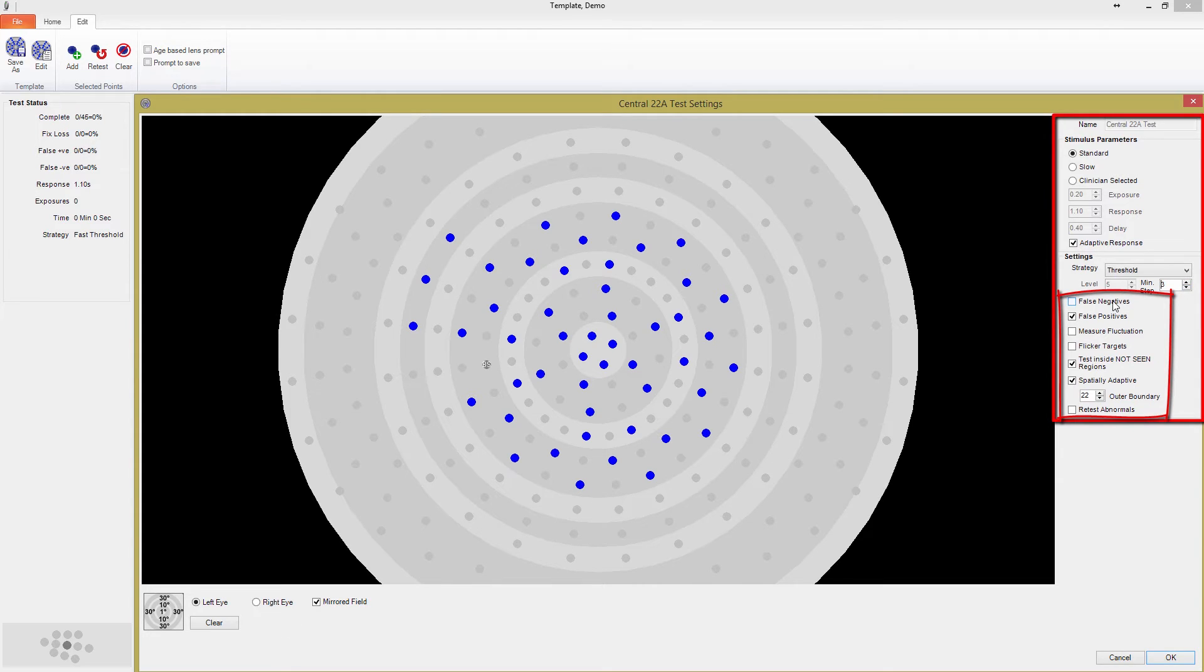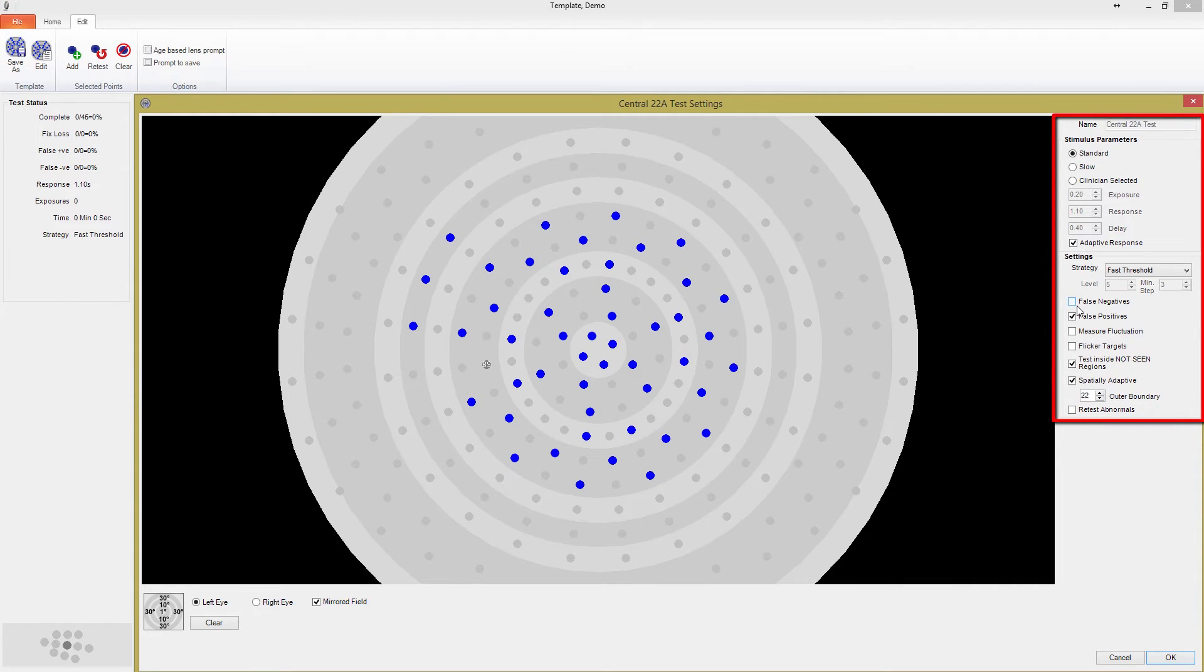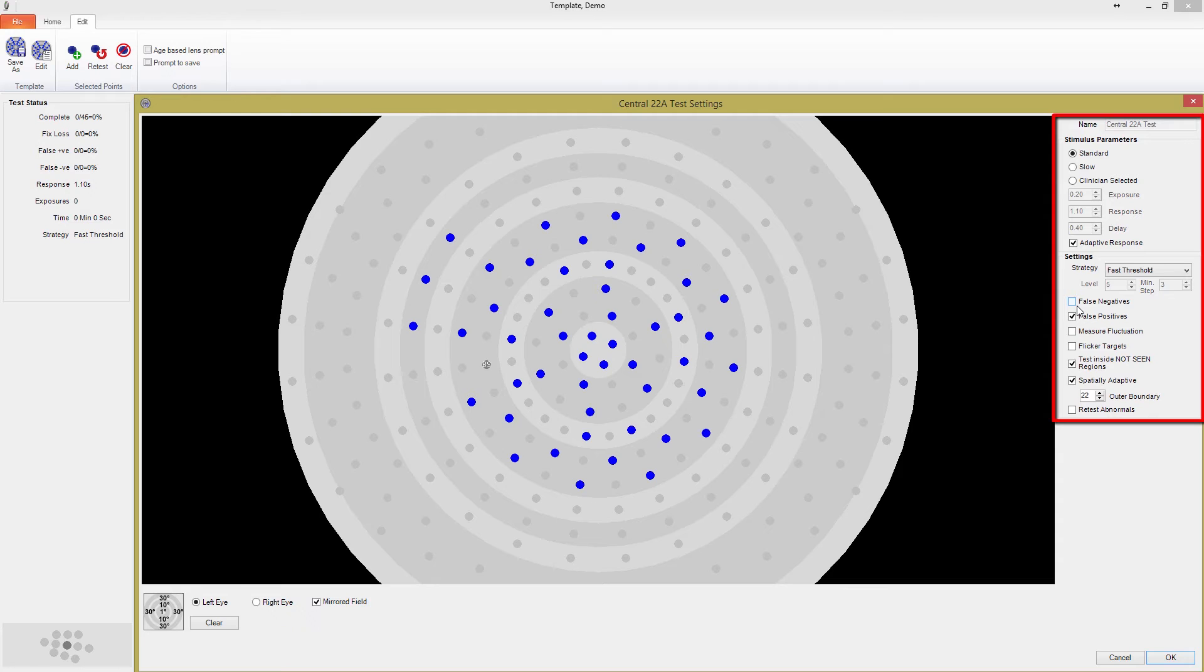Continuing down, we now have a number of settings that can be turned on or off. Many of the fast screening test strategies have false negatives turned off as a default. If a patient doesn't respond to a point in a location where their threshold is already known, this is marked as a false negative. Many of our fast screening tests have false negatives turned off as a default, since false negatives often occur during longer tests when patients stop paying attention. It is up to you to make the decision as to how important this indicator is for the template you are designing. At low numbers, in shorter tests, they have little statistical significance, and may just make the test unnecessarily longer.